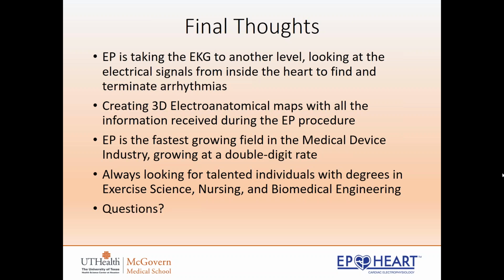Awesome. What exactly does the catheter do? So the catheters inside the heart that I showed the picture of, they just give us signals. That's all the catheters do inside the heart. They give us signals. And then we put up a specific catheter called an ablation catheter, and that catheter is able to actually burn the heart tissue using radio frequency energy. So we'll look for the signals inside the heart, we'll find where it comes from, and then we actually burn the tissue. So we're burning inside on the endocardium of the heart to get rid of that signal so that little area of tissue cannot generate the arrhythmia. So it helps it to terminate so they don't have it anymore.